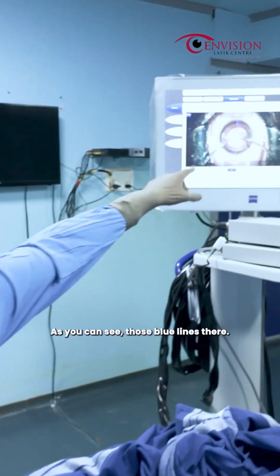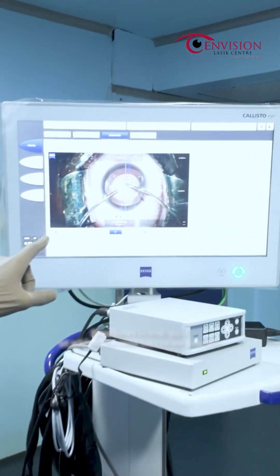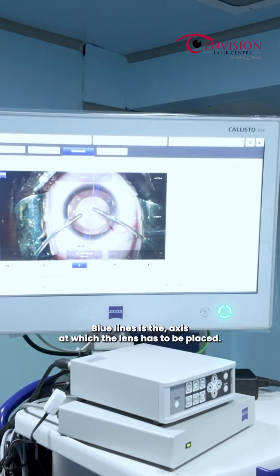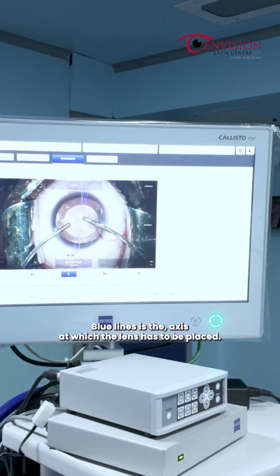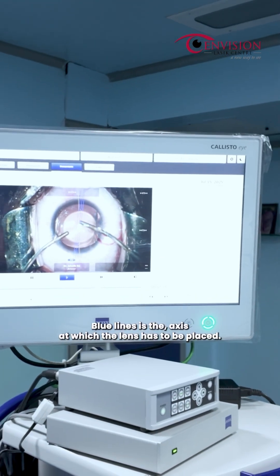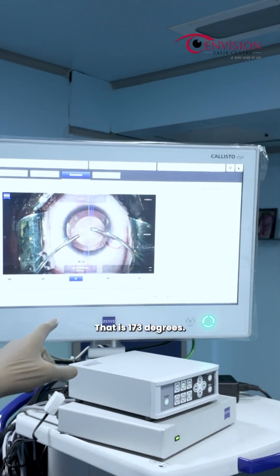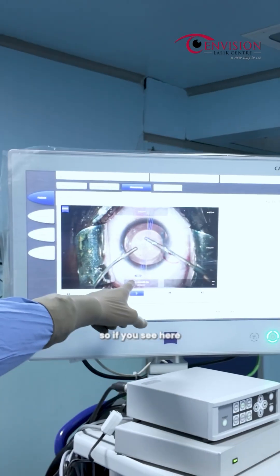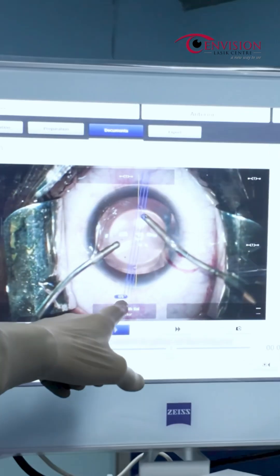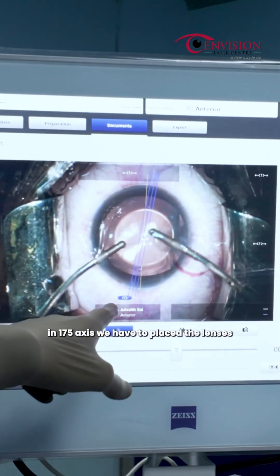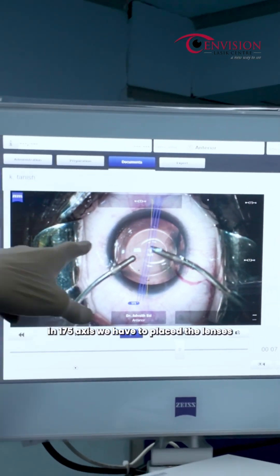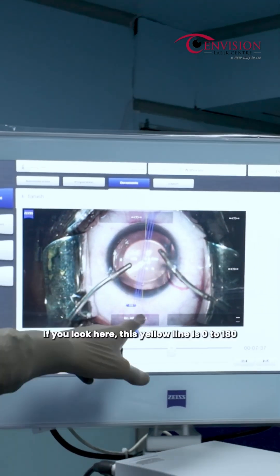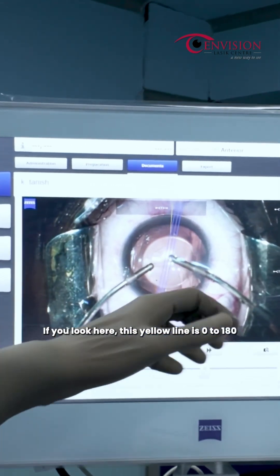You can see those blue lines — the blue lines indicate the axis at which the lens has to be placed, which is 173 degrees. So you place the lens along the 173-degree axis. The yellow line represents the 0-180 degree reference.